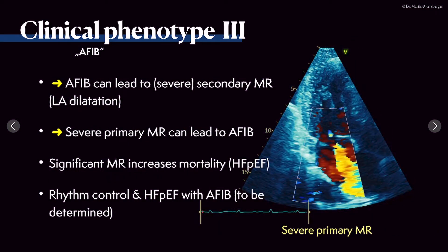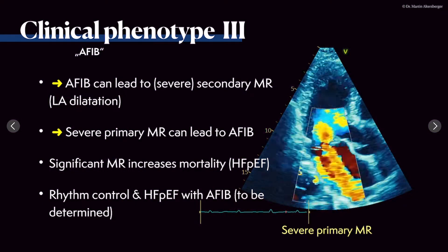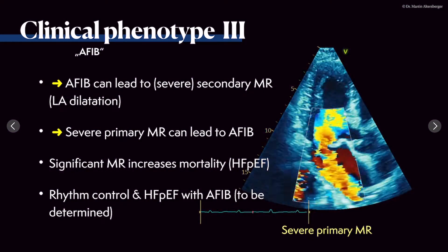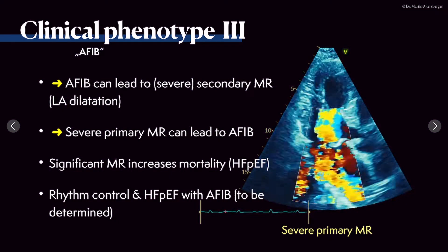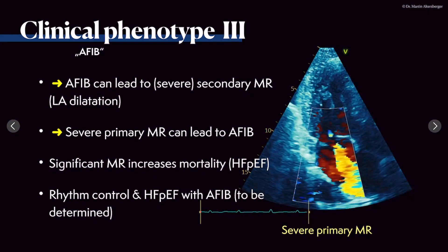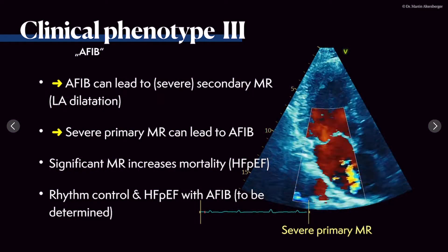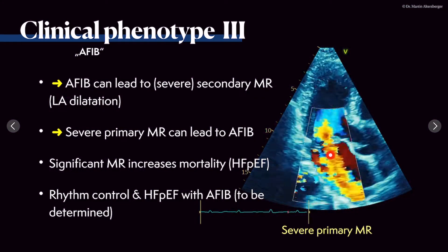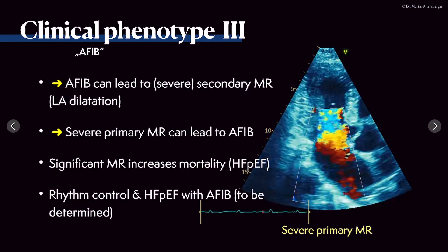We are not done yet with atrial fibrillation, because AFib can also lead to severe secondary mitral regurgitation. In the case of a dilated left atrium, we can have severe mitral regurgitation. You have to differentiate between secondary mitral regurgitation due to LA dilatation or left ventricular dilatation, and differentiate it from severe primary MR. This is a patient with an example of severe MR due to a primary cause — this patient had a prolapse and a partial flail leaflet.